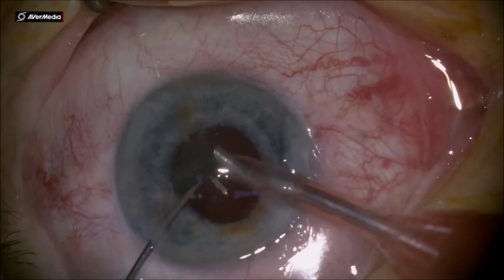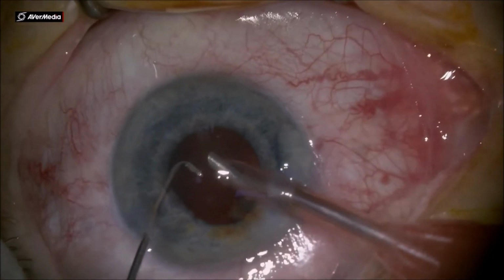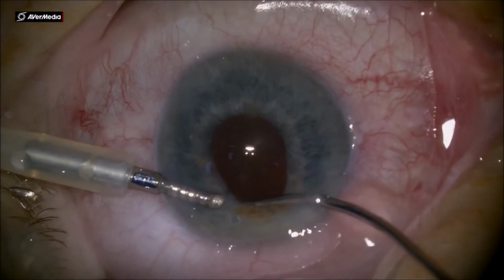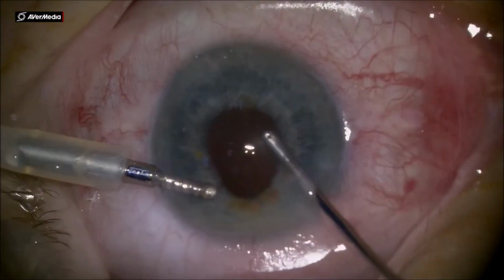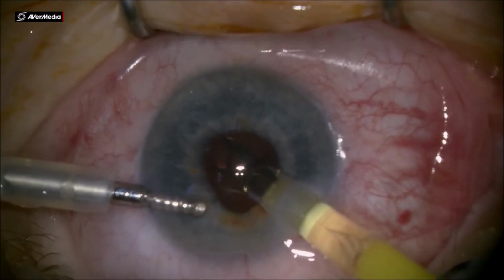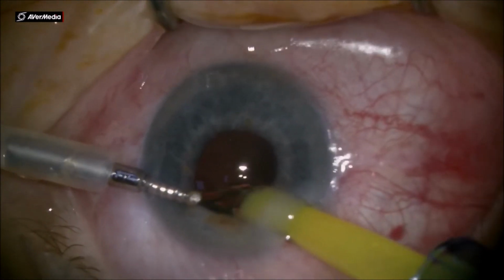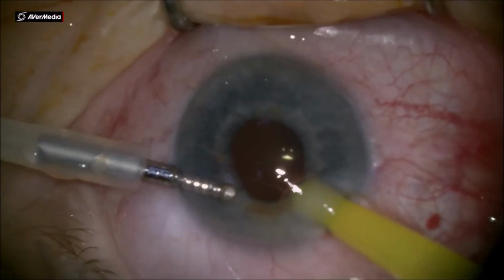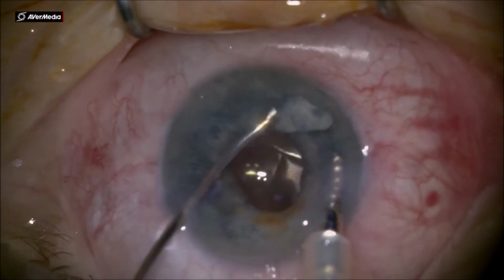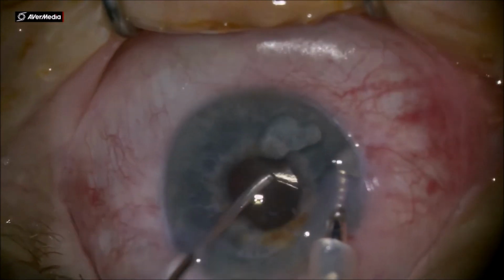And taking your time and doing this very methodically will ensure that you'll have a good surgery. And most of the cortex is out. I'll have another piece here at 12 o'clock, and then injecting the IOL under irrigation from the AC maintainer, and using the injector to place inside the bag. Even the trailing haptic will help you out. Taking out the viscoelastic at the end of the surgery, and that's pretty much it.